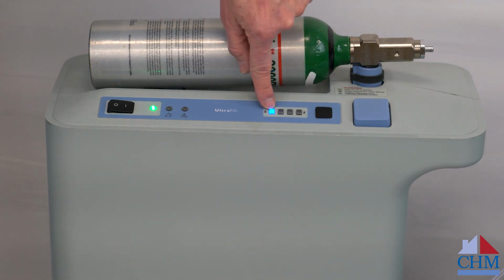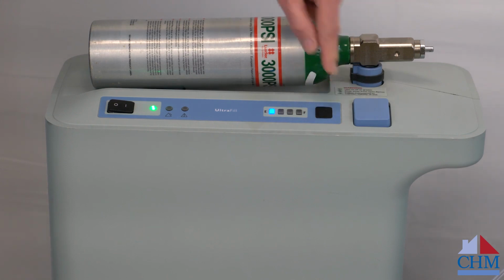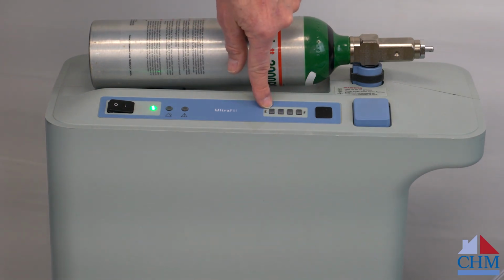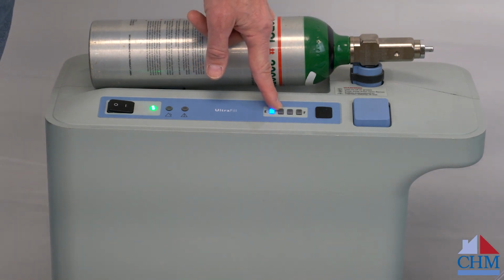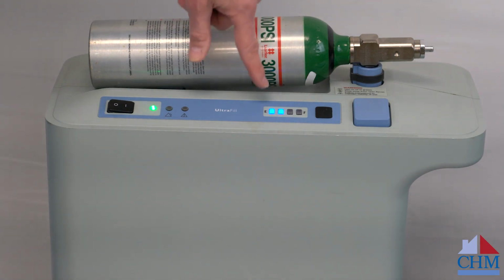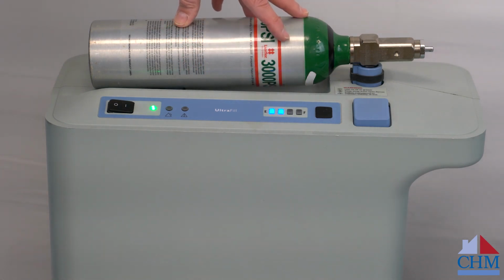But you'll notice right now this blue light is just on and it's not flashing. Notice when I hit the button, the sound changes. You can hear the compressors kick in and start to fill the tank. And you'll also notice that that light is flashing. Now it'll take a couple of hours to fill a tank. The reason this one is going up quicker is because there's already contents in this cylinder, okay? So the filling process is going quite rapidly here because it's already sensing that there's oxygen in this tank.